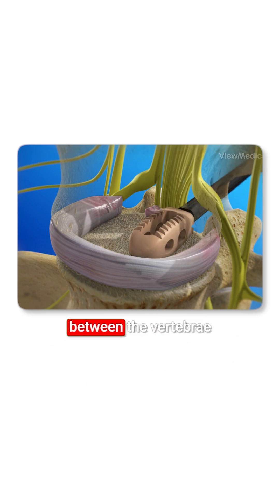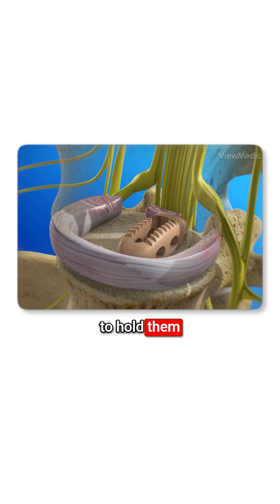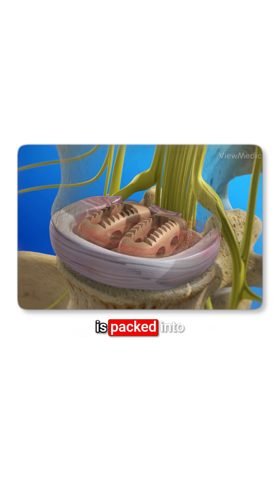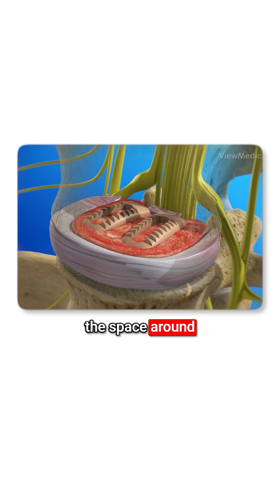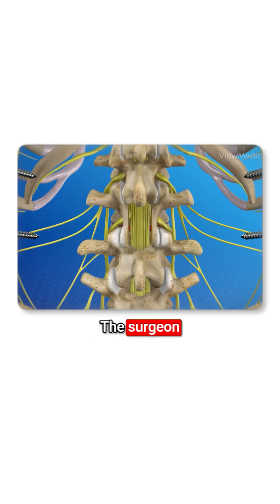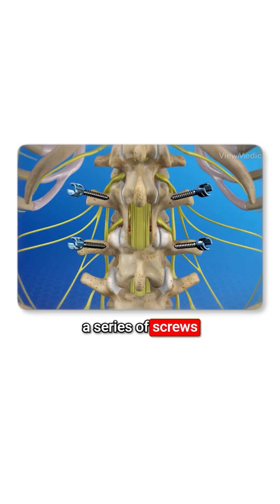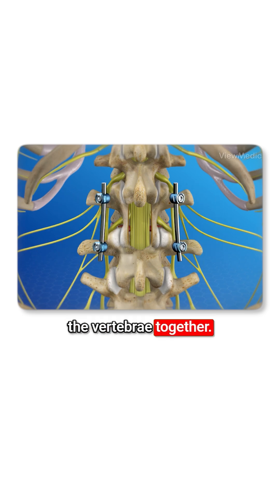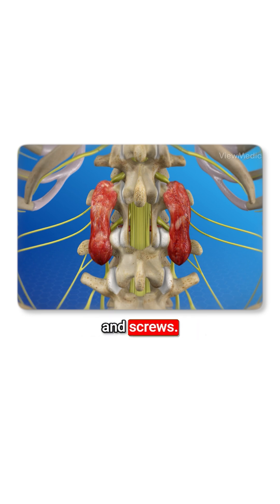Implants are placed between the vertebrae to hold them in the proper position, and bone graft material is packed into the space around the implants. The surgeon may implant a series of screws and rods at the rear of your spine to help lock the vertebrae together, with bone graft placed along these rods and screws.